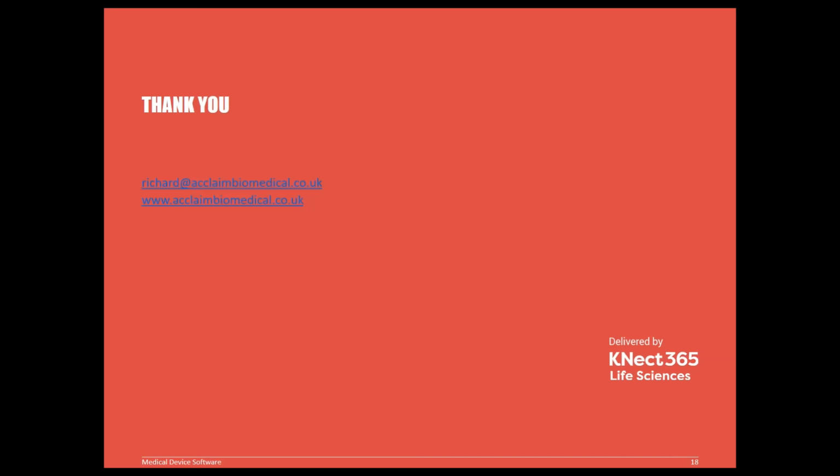your application. And yes, there's specific mention of usability within the essential requirements, but as I'm running the presentation, I haven't memorized all the essential requirements yet, because there's a lot more of them than there used to be. There's 19 when there used to be 13. But yes, usability is an essential requirement of devices in the new accepted text of the European regulations.